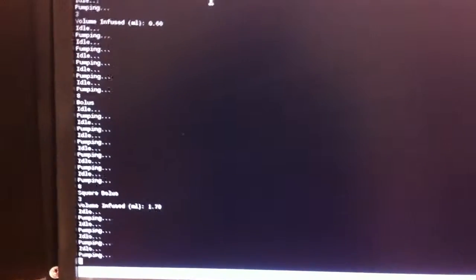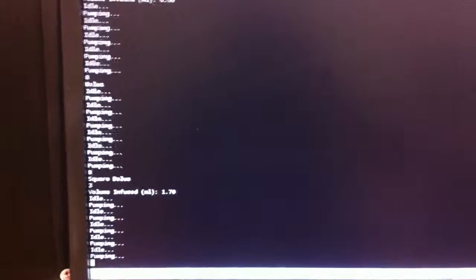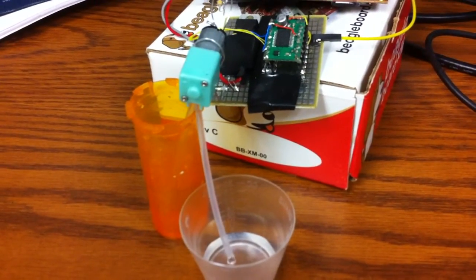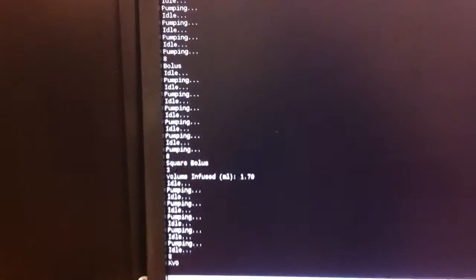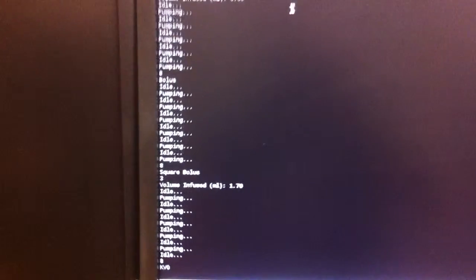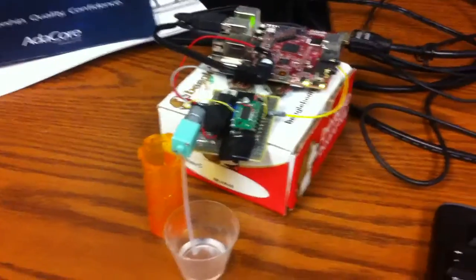Okay, so I believe this is the last one. And let's see, the pump is still running. And now it's stopped. It's idle. And the state is KVO rate. And now, as I said, the clinician has to restart the pump in order to make it continue working. Thank you.